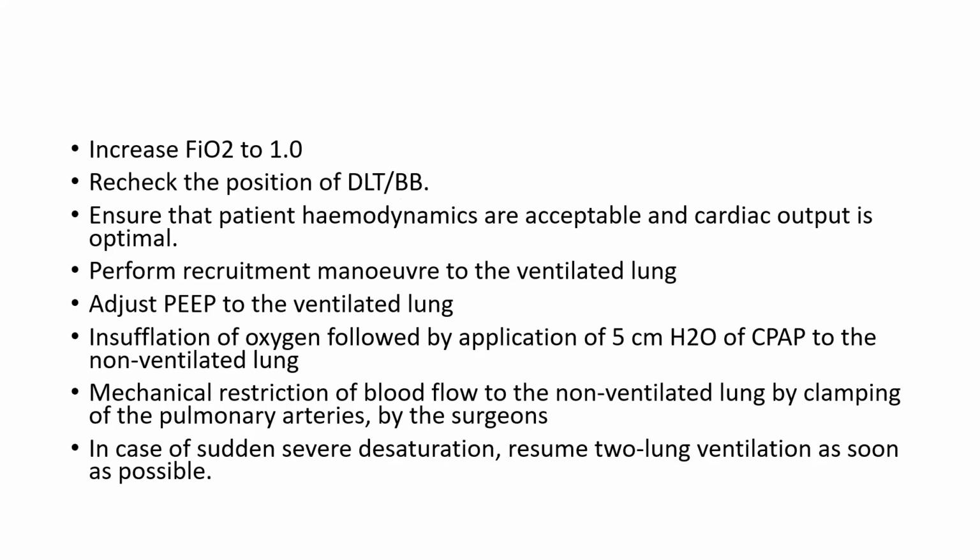Then at the same time, we have to ensure that the patient's hemodynamics are acceptable. BP is acceptable because hypotension can actually cause desaturation as well. Okay. Then let's say positioning is okay, BP is okay. Then we can perform a recruitment maneuver to the ventilated lung, as well as apply CPAP to the non-ventilated lung. Application of CPAP can cause inflation of the lung, so it may cause problems to the surgical view. So we have to have good communication with the surgeon.